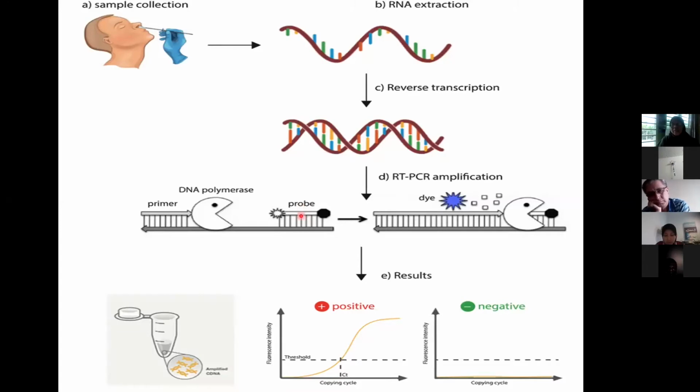So if there is a contamination that affects the fluorescence properties, you might end up with a false negative result. Even though this is possible, RT-PCR is still the most convincing technique for COVID-19, or novel coronavirus, detection. But the issues are, the steps are tedious and you have to do it meticulously.